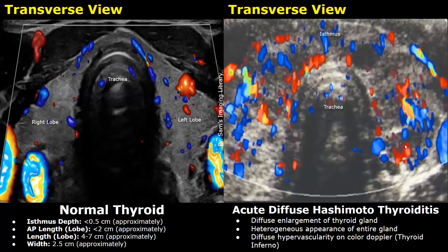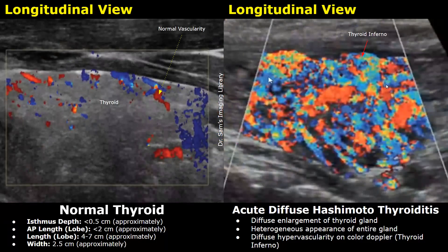This increased vascularity is called 'thyroid inferno' — many Doppler signals are seen and the thyroid appears enlarged and heterogeneous. Comparing a normal color Doppler image in the longitudinal plane, which shows only a few Doppler signals, with a case of Hashimoto thyroiditis where thyroid inferno is noted, we see many color Doppler signals within the thyroid indicating increased vascularity.